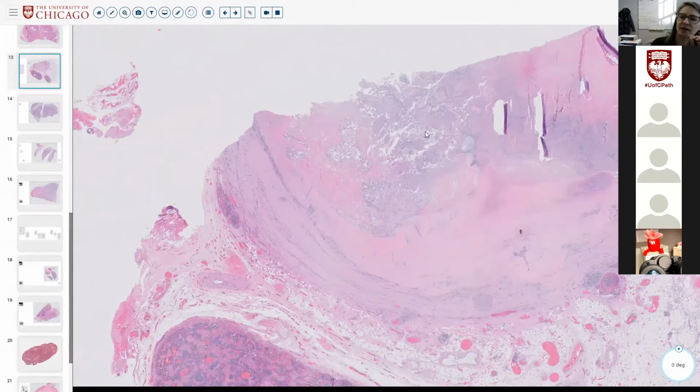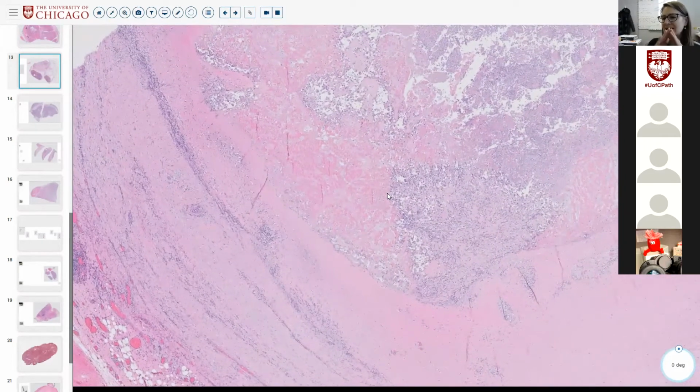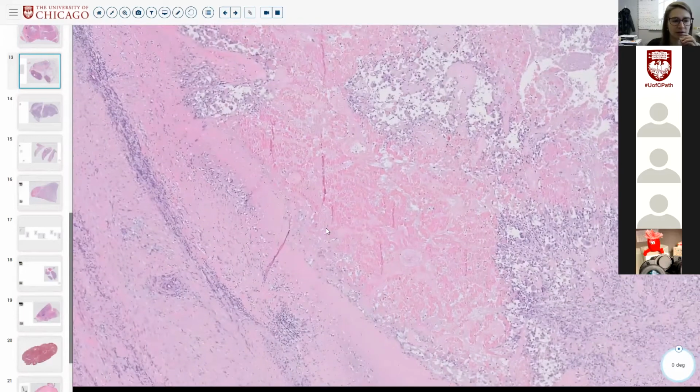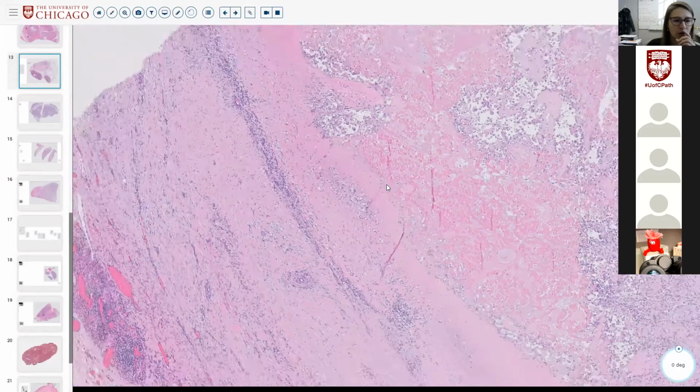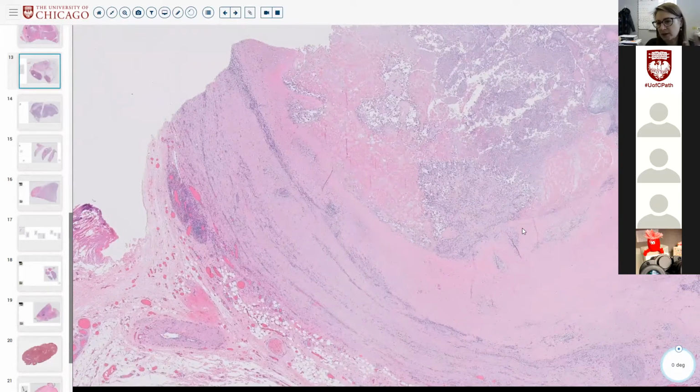And so Hürthle cell neoplasms are extremely sensitive to poking, and they often just completely infarct or partially infarct and leave a rind of viable tumor. And so that is quite particular to Hürthle cell things. So what makes me know that this was a post-biopsy infarction was, number one, I know that it was biopsied. We have a chart, we can ask, we can look.